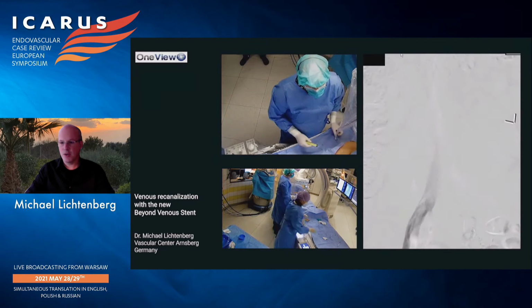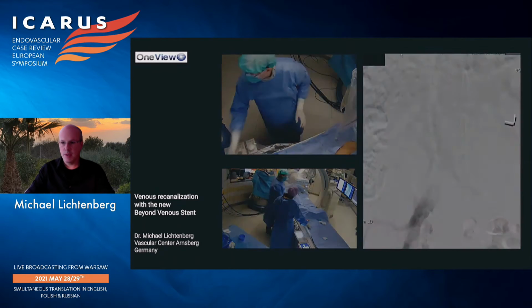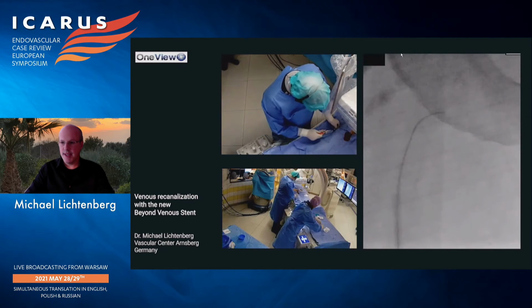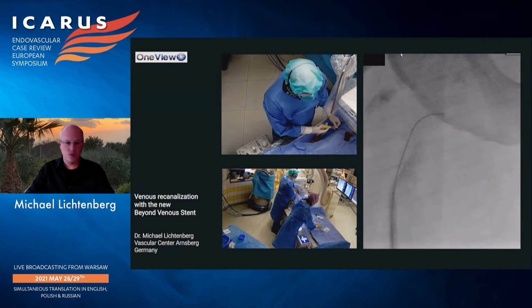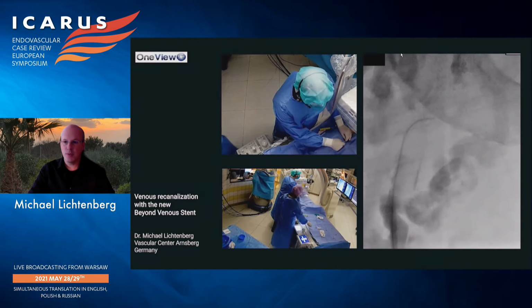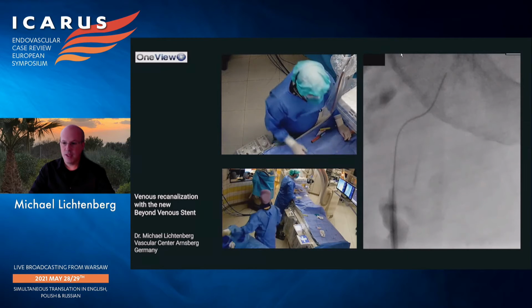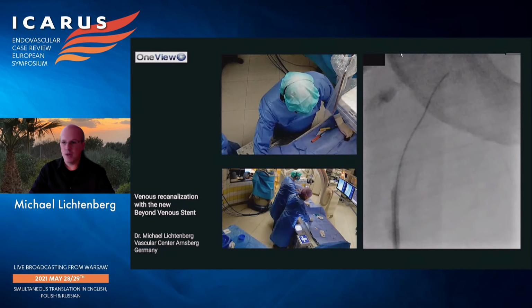This is the diagnostic phlebography. As you could see, this is the outflow, maybe some little post-thrombotic changes. The issue with all these post-IV drug abuse patients is a totally destroyed common femoral groin, which looks very ugly. There's just scar tissue. There's really nothing. So it's always difficult to penetrate to this non-existing vessel region.